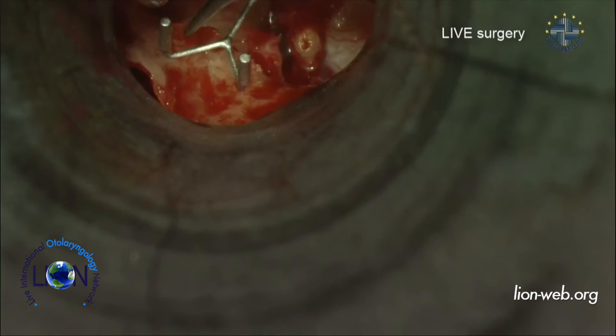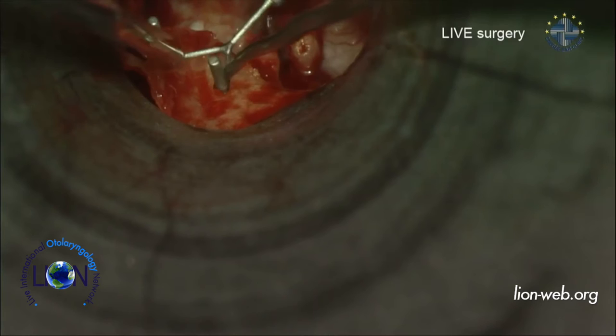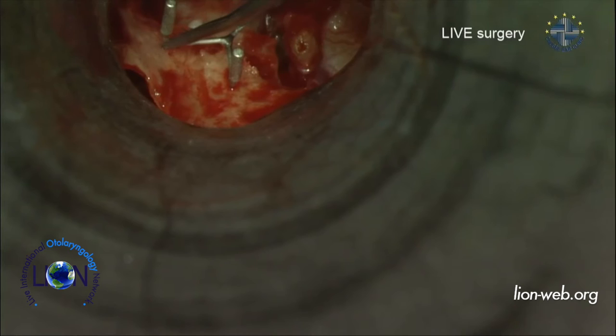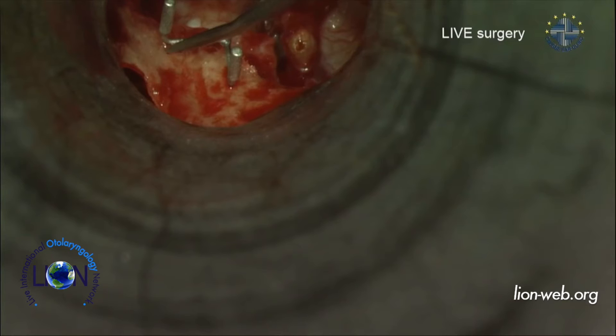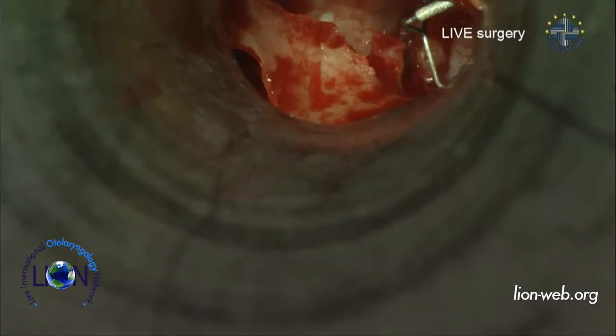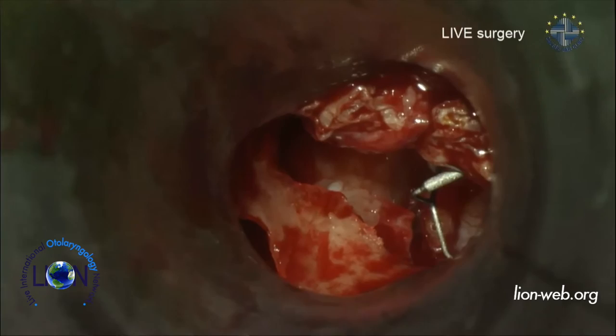Bone is fine here. Yeah, it looks fine. So if I put the first one here, I think this bone is very thin, so I need to drill out very progressively. So I will try to make a hole here, and then I'll see for the second one. Let's try the first hole. Now, we're using a 0.6 millimeter diameter diamond dust burr. I need to increase the light. And it pedal now, using this diamond dust burr.